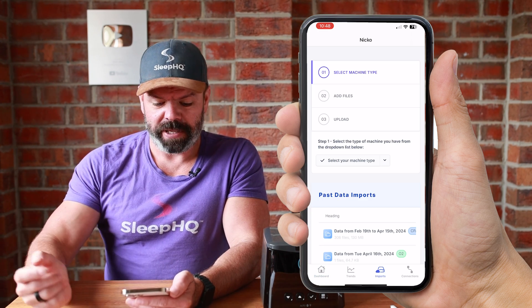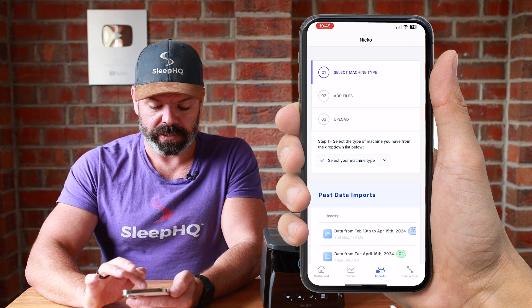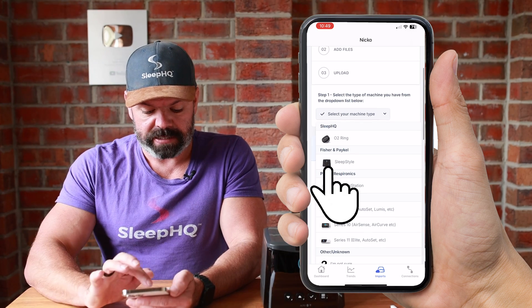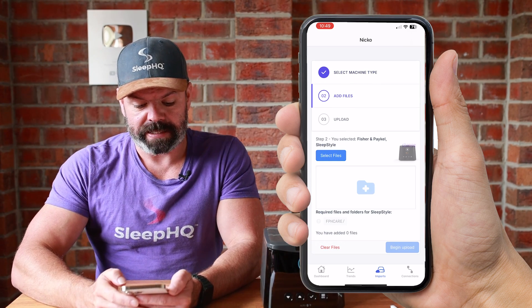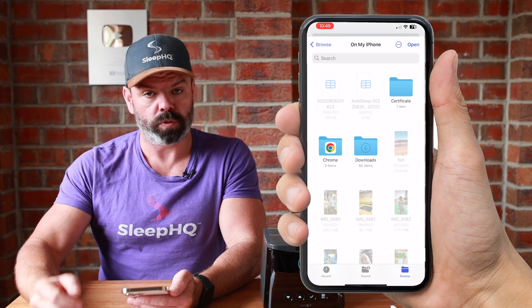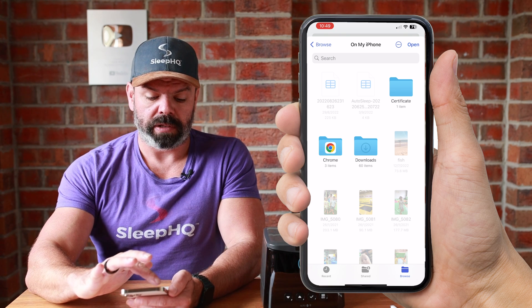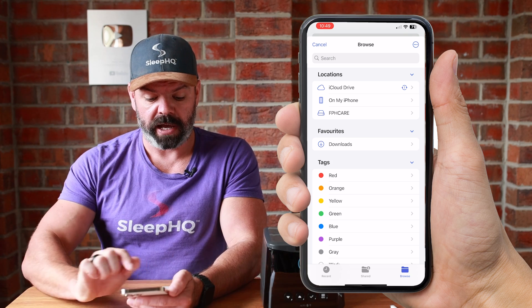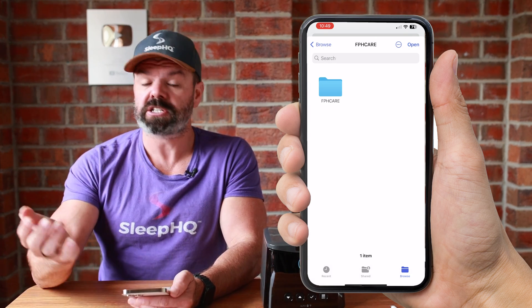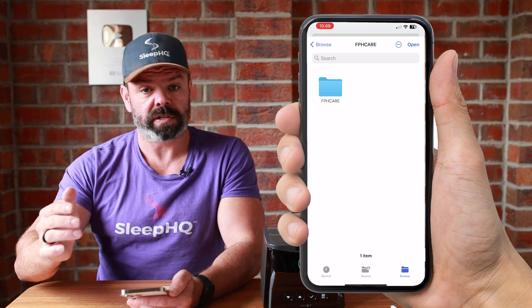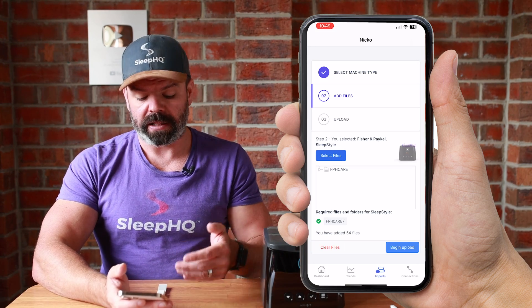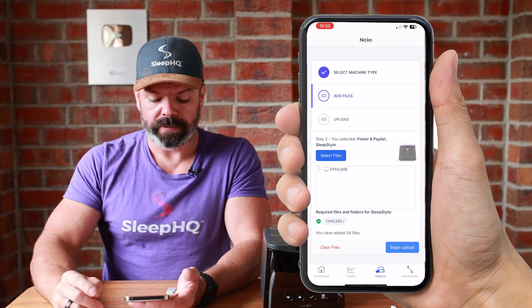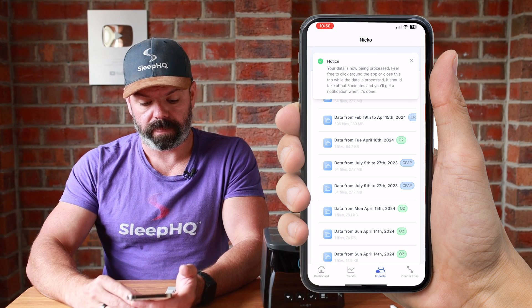Let's go to imports down the bottom. Step one: select machine. If we click this, these are all the devices compatible with SleepHQ — ResMed devices, Fisher & Paykel, Philips, and we're adding more shortly. Here's the SleepStyle. Number one is done. Number two: add files. Tap select files — this will open up the files app on your phone. Tap browse at the top left; after the first time you shouldn't have to tap browse again. Locate the folder where all the files are — FPH Care. Tap that, then tap open. We don't need to go into sub-folders; once we've selected the drive, tap open. SleepHQ has analyzed the files on the dongle, and you can see a green tick next to the FPH Care folder. Then tap begin upload.